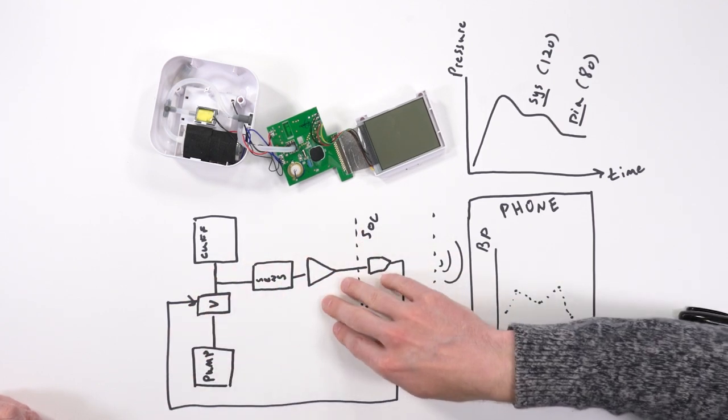Okay. So it's using that loop and then it's going to determine your blood pressure basically. Now, you said the SOC takes that in. Once we have that information, what does it do with it? I'm assuming this is where the connectivity comes in.